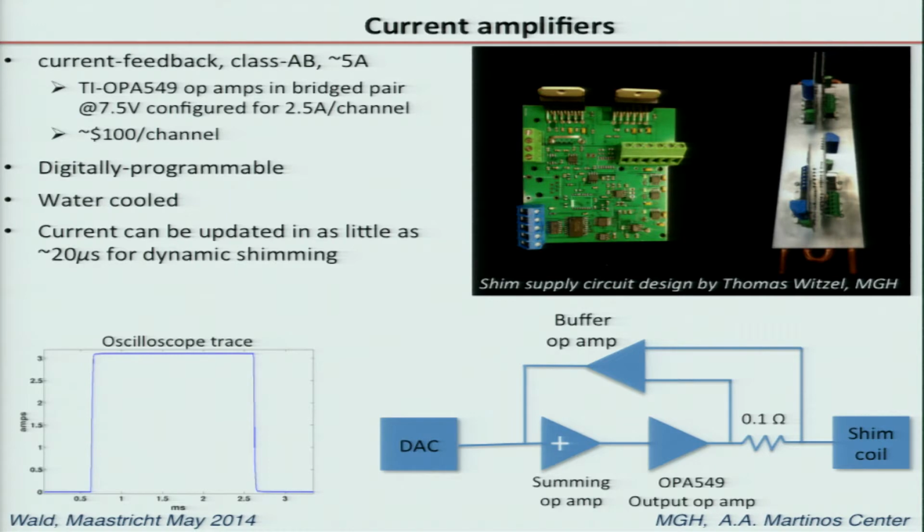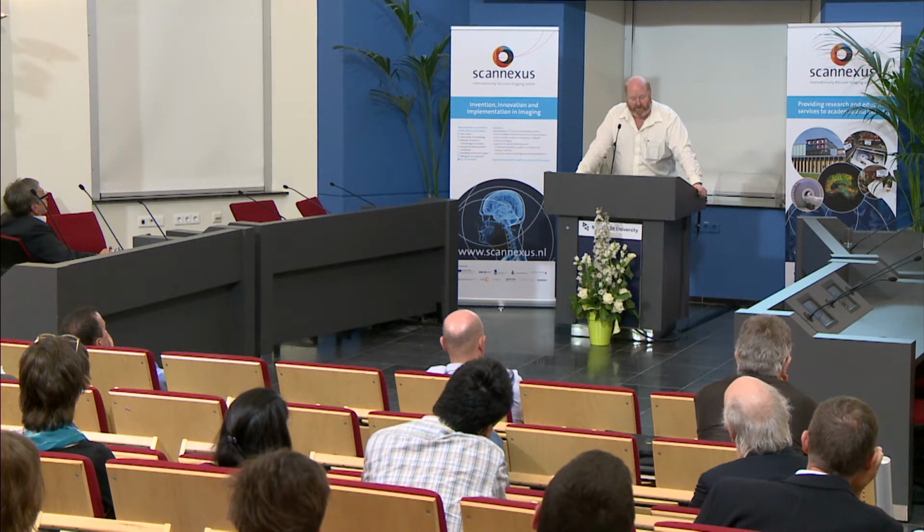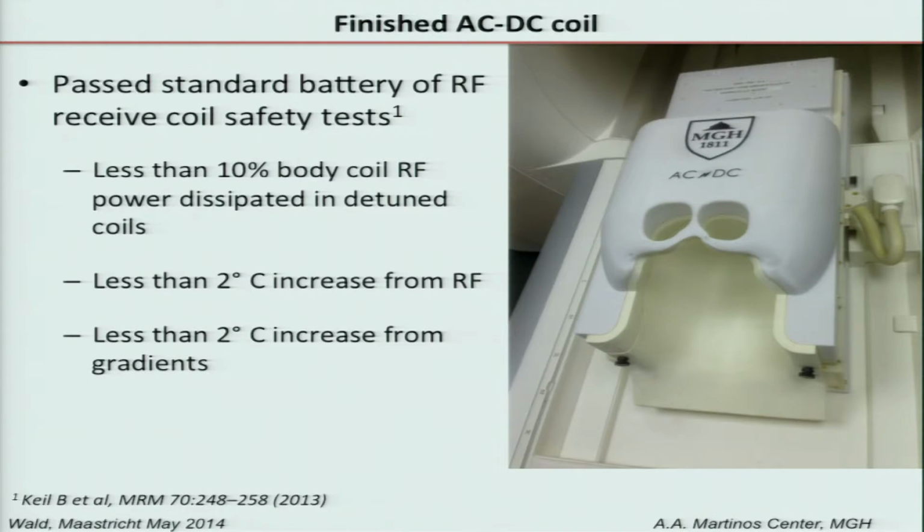That's hard to do in spherical harmonics because of the big inductance. It's also a problem in spherical harmonics because if you switch fast, you generate eddy currents in the bore. Well, in this case, this little loop is so far from the bore, eddy currents don't seem to be a problem. So it really solves a couple of issues. So here's our little boards and a big power supply, which sits outside the room. The boards are non-magnetic, so they sit right behind the magnet.